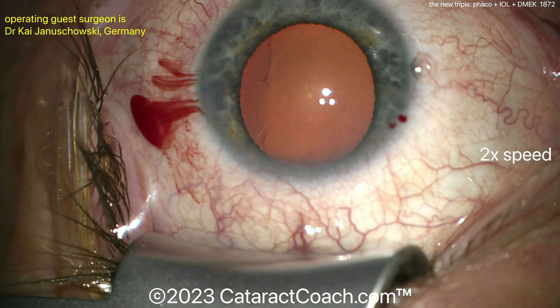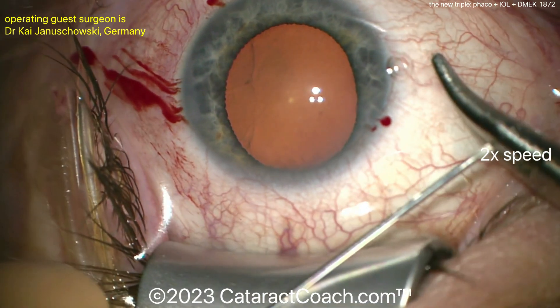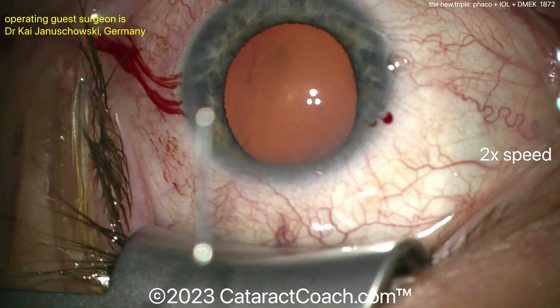I have sped the video up to 2x, so two times normal speed. But even then, at regular speed, this is a very efficient case — obviously a very experienced surgeon here. So bending a needle to make a cystitome.